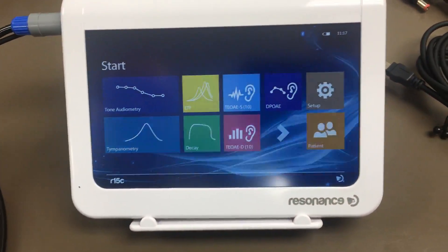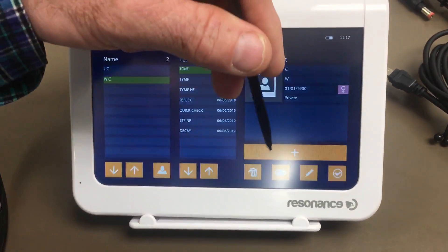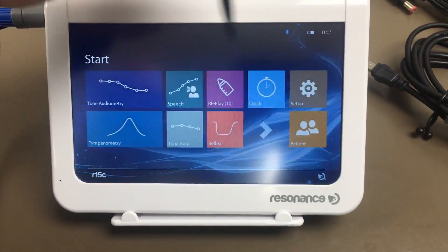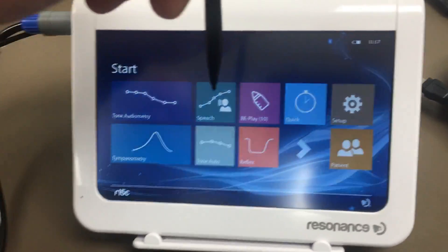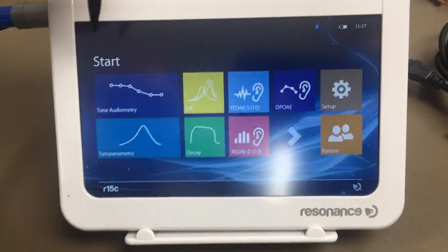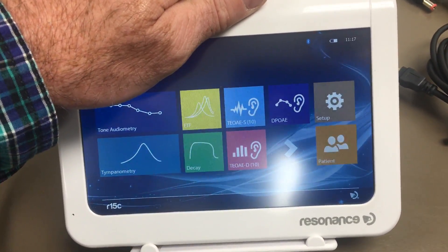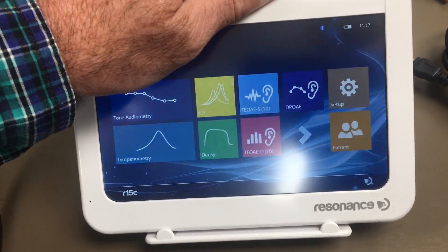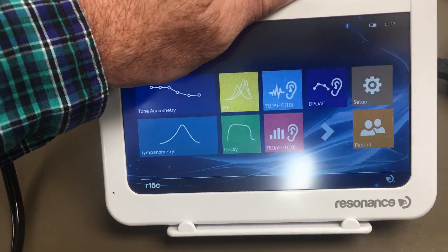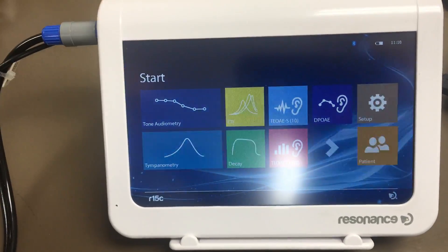To wrap up: we covered how to set up a patient, and we talked about all the tests — tone audiometry, children's replay, tympanometry, reflexes, decay, ETF, and quick. If you have any questions or concerns, give us a call or send us an email at info@eartech.com.